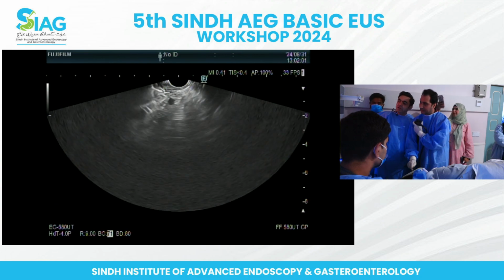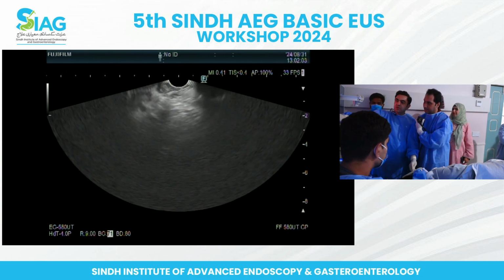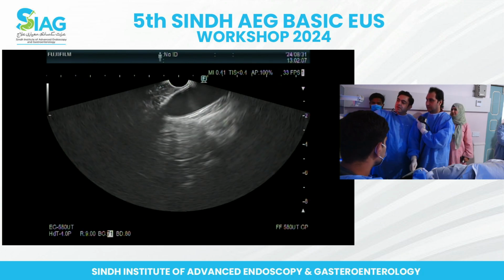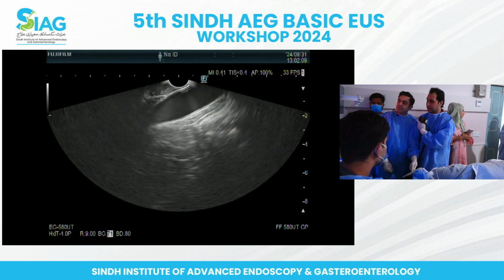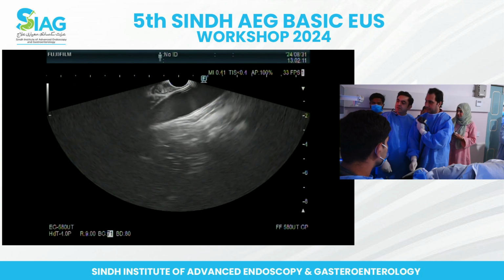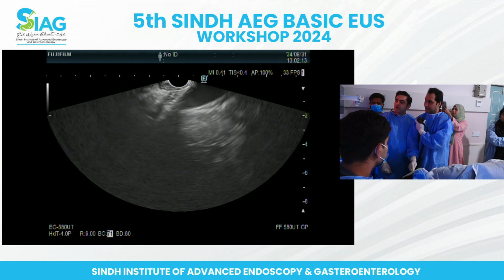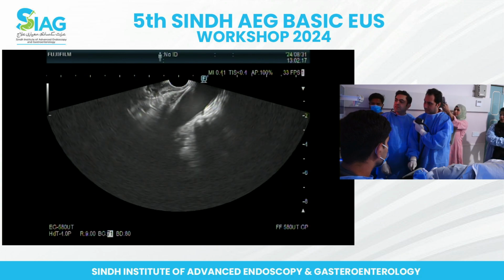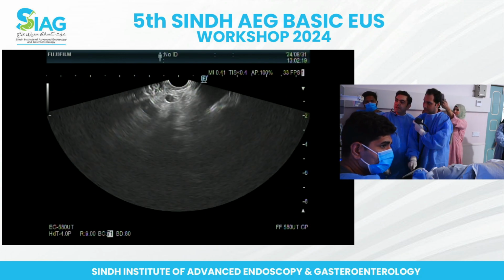Don't worry, don't worry. You are in the right place. Now, I think you've moved your little wheel. That's why you can't get it in place. It's in the neutral position. Yes, okay. Push the scope in, because we need to be a bit lower down. Yeah, another couple of centimeters lower down. Yeah, we'll find that image, don't worry.